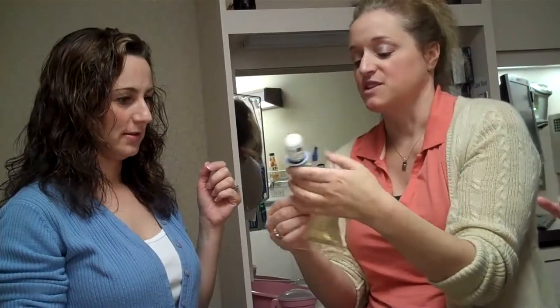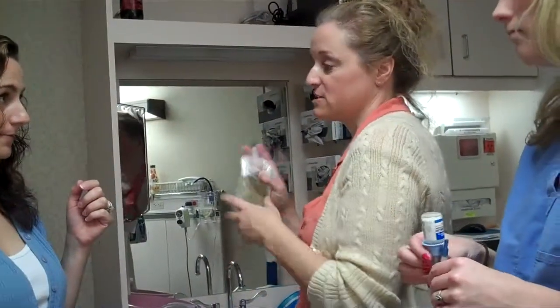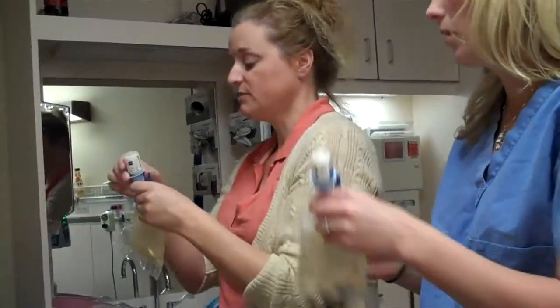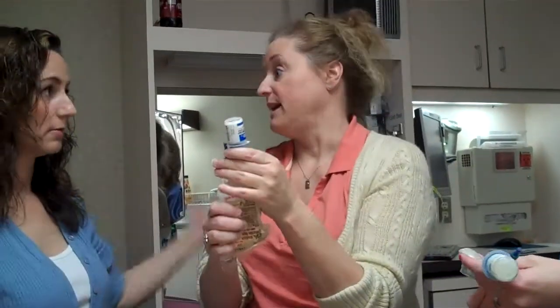And then you'll see that this fizz will go down. Then you're just going to store it in the refrigerator until tomorrow. And these are the bags you can use tomorrow. Both of them, because he needs 2 bags a day. Just back to back, or do we do them at...? Back to back. Yeah.